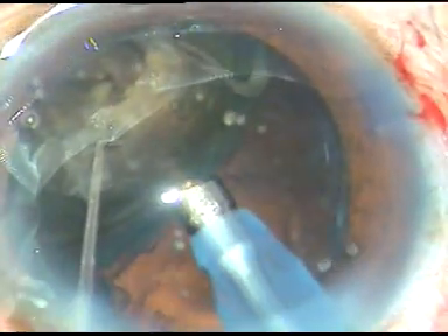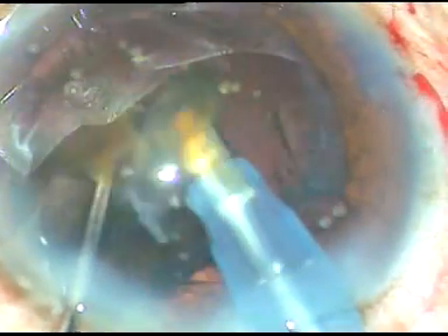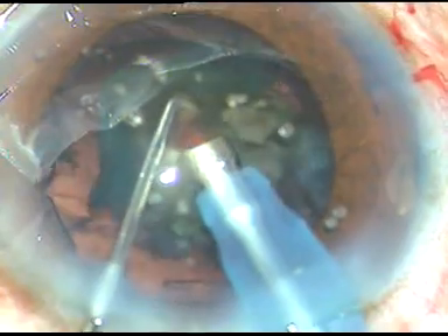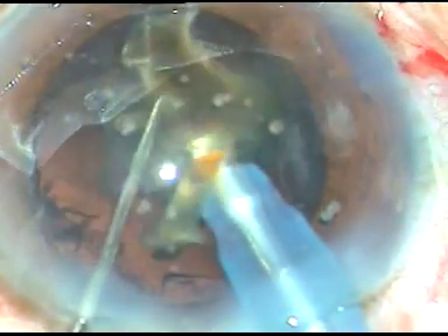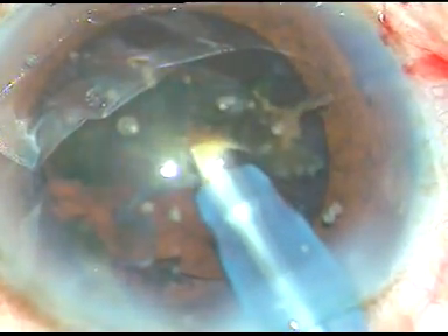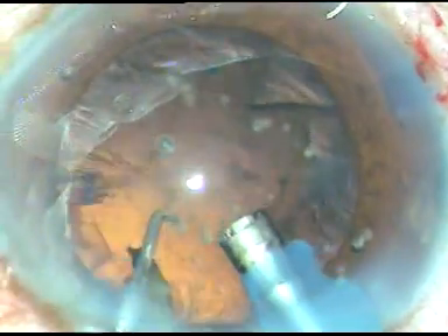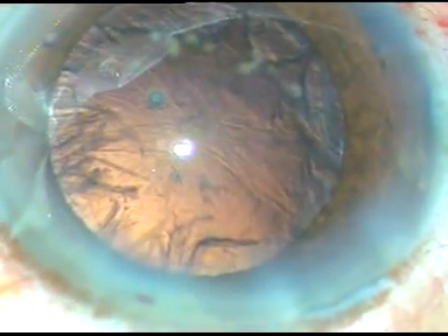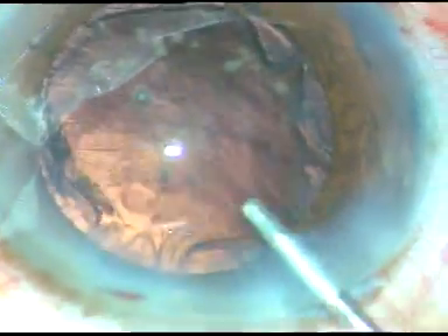Here it is. I go from here and attack from the apex and the two pieces become separate. That's it — this is the last small piece. A portion of this piece is emulsified. And then I remove the chopper for the last small bits so that the chamber becomes more stable. That's it — we have conquered a black cataract.